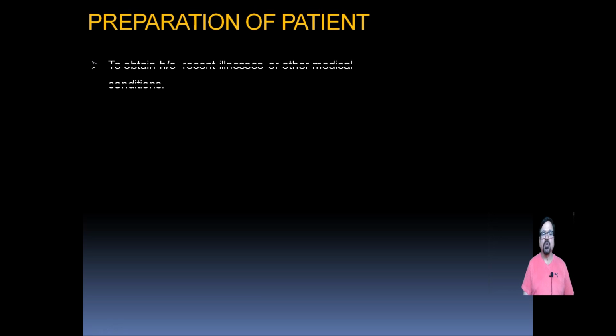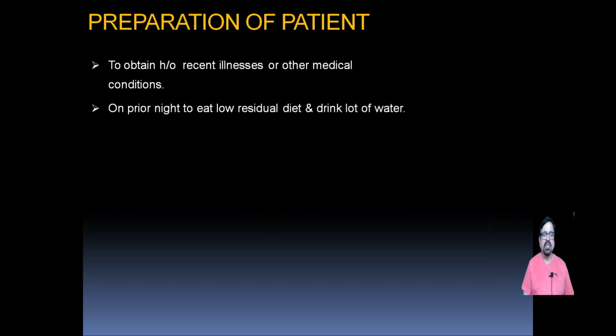Our practice is not to exceed 100 kVs in any of the studies, and we keep our kV range around 70 to 85, and we never exceed 100. However, it is an institutional practice and can differ from center to center.